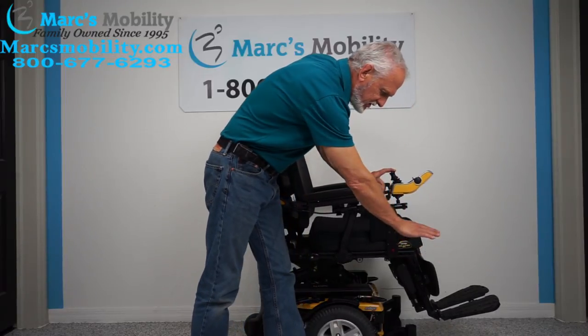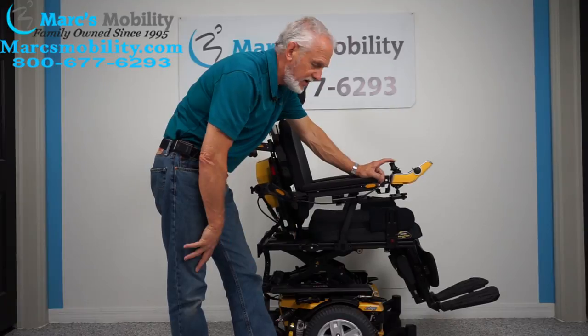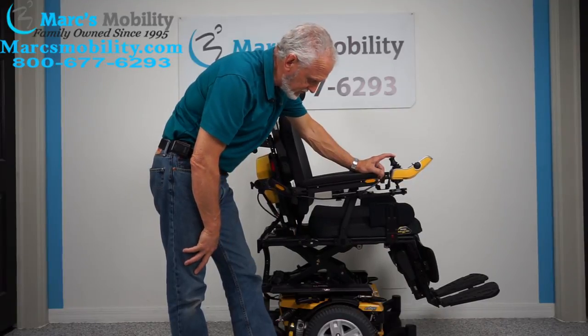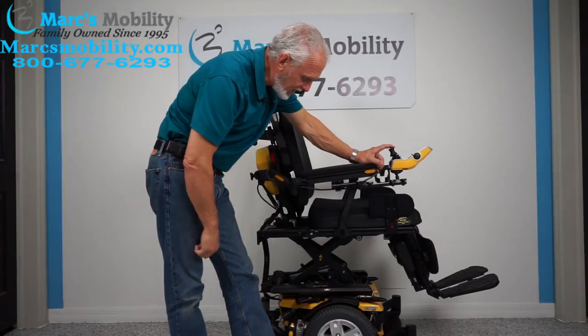When you start, you're going to start roughly at 22 inches. When the seat is elevated all the way to the top, you'll be at 10 inches higher — at 32 inches. So remember, this chair has a 400 pound weight capability.